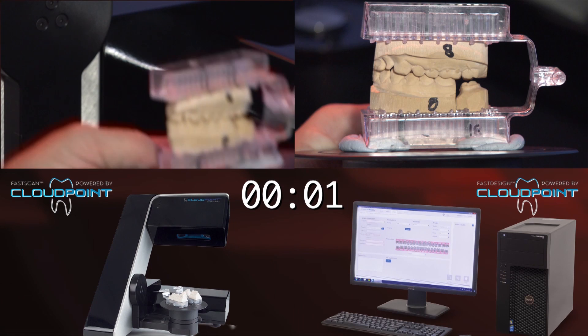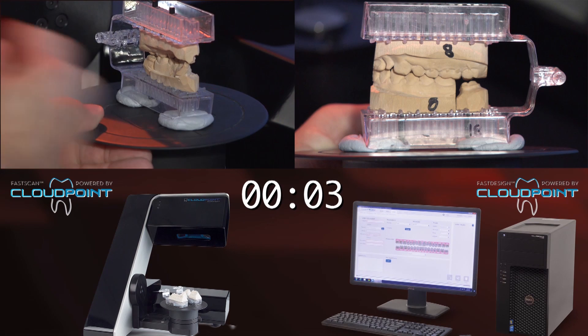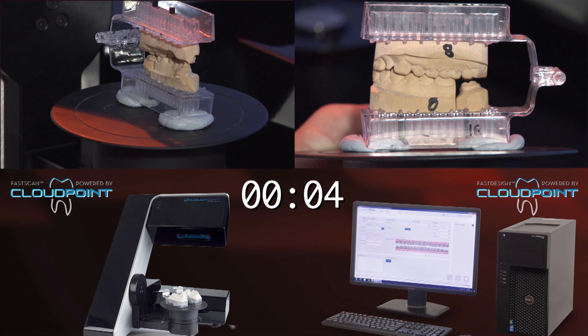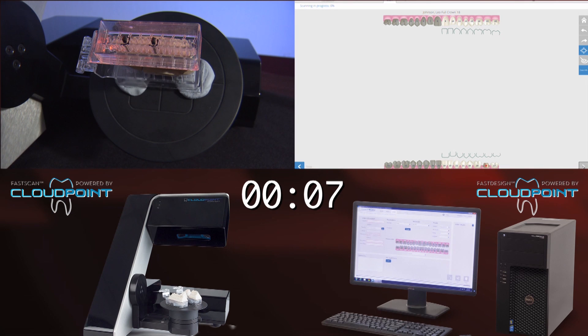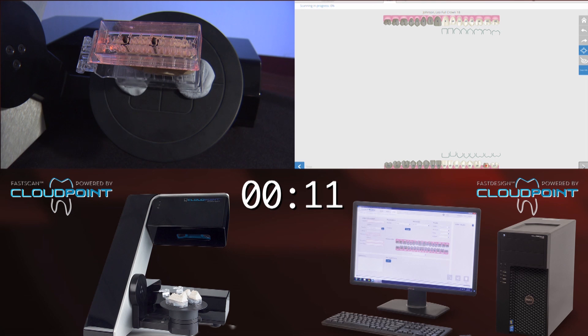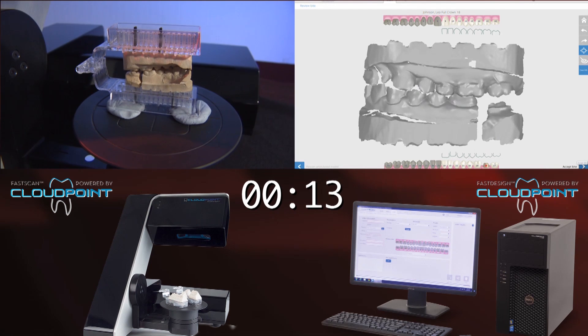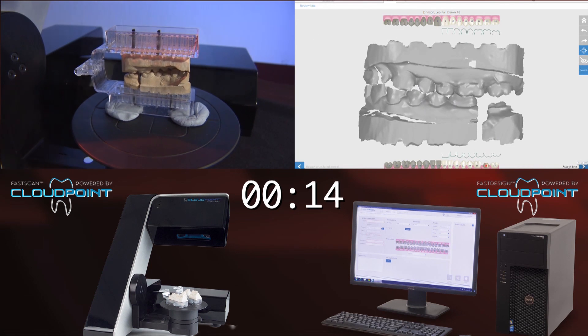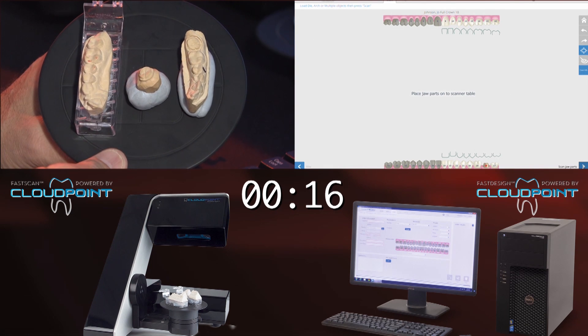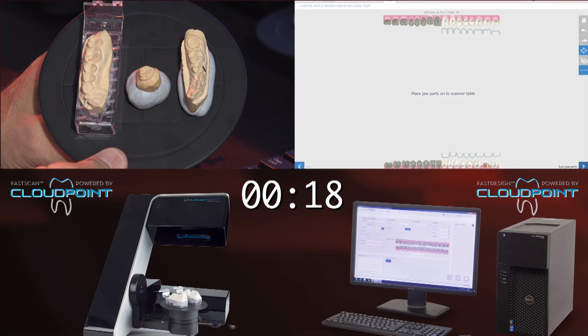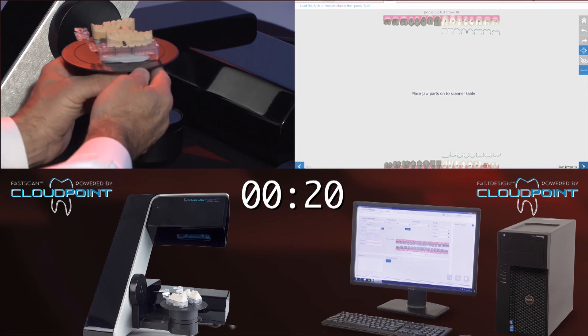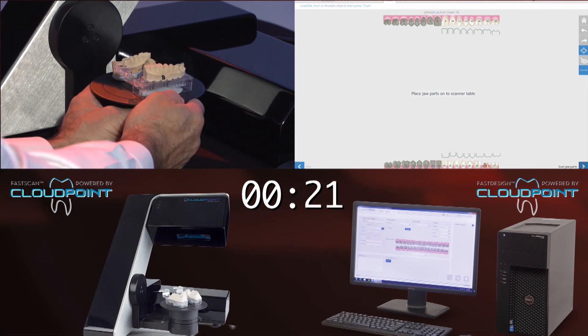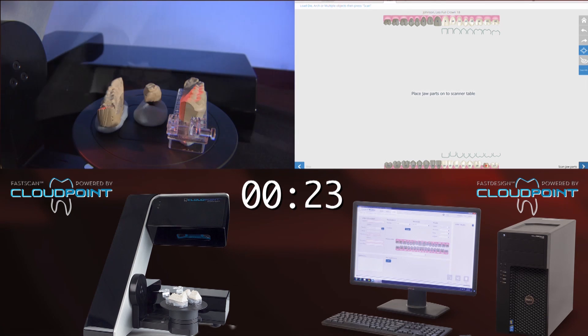Once the models are poured, they're affixed to a little plate that you can see in there, a platform with some putty. The device is actually going to scan it with a blue light, and you can see it turning it at several different angles. Typically, you had to move a laser light around or you had to do it by hand to be able to scan all of these.